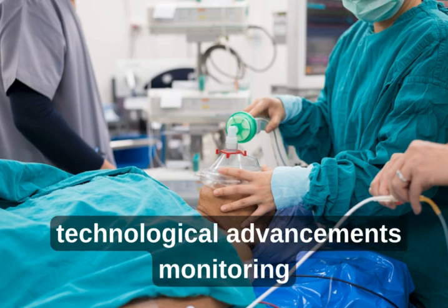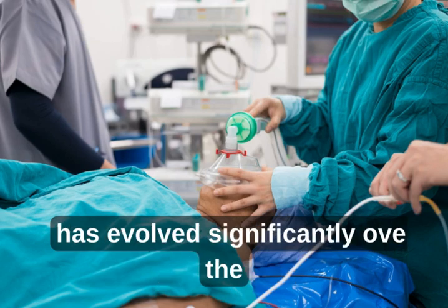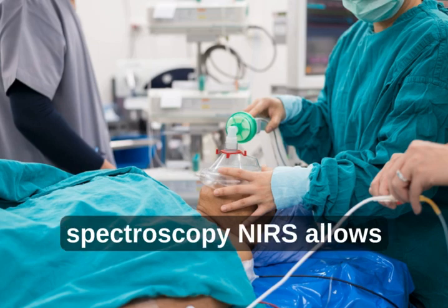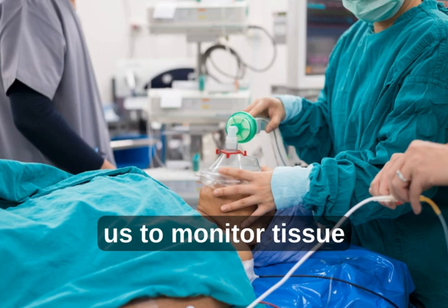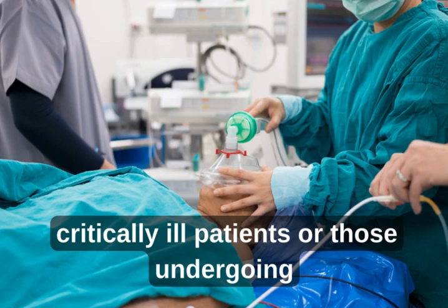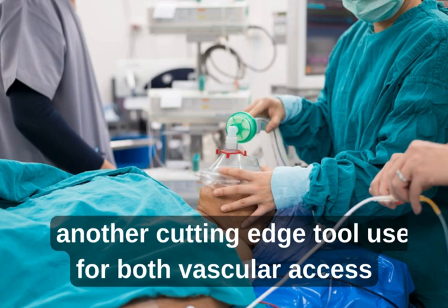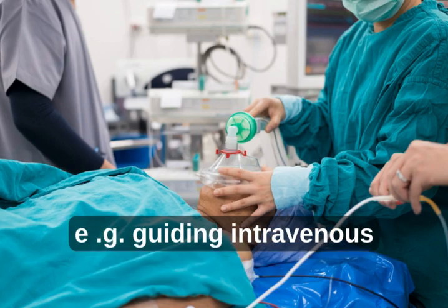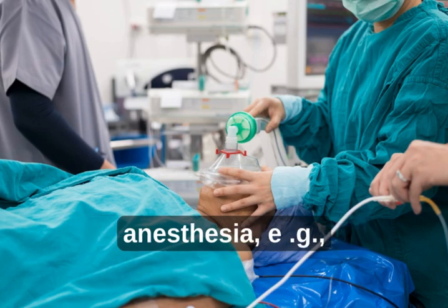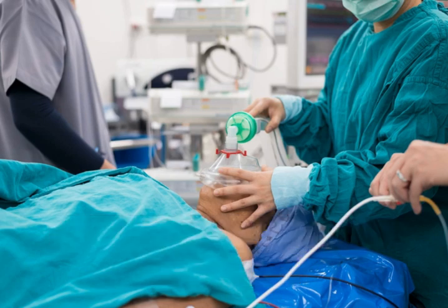7. Technological advancements in monitoring. The landscape of anesthesia monitoring has evolved significantly over the past few years. Near-infrared spectroscopy, NIRS, allows us to monitor tissue oxygenation in real time, especially in critically ill patients or those undergoing long surgeries. Ultrasound is another cutting-edge tool used for both vascular access, e.g., guiding central venous catheter placement, and regional anesthesia, e.g., nerve blocks, allowing us to improve the precision of these procedures.